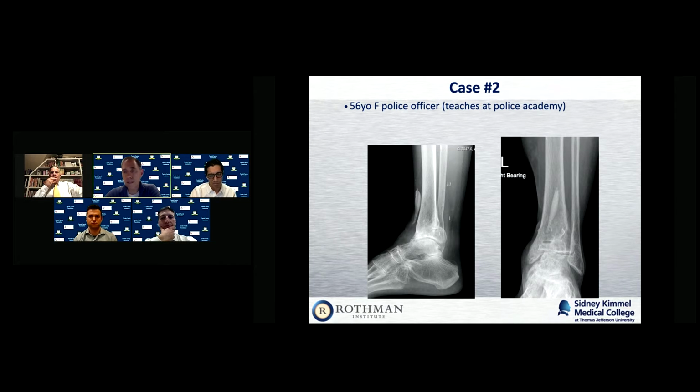Dan, anything else of interest on the x-rays? I'm not sure what that ossification or calcification is anterior to the tibia. But I'd be interested to know more of the history, what the prior surgeries were. It looks like there's some type of staples. Yeah, those are vascular. Hear about flap. Looks like, was this an open injury? Yeah, it was. See what her soft tissue's like. Yeah, so she's 10 years out from ORIF of a tib-fib. She had removal of hardware. She had a skin graft posteriorly.